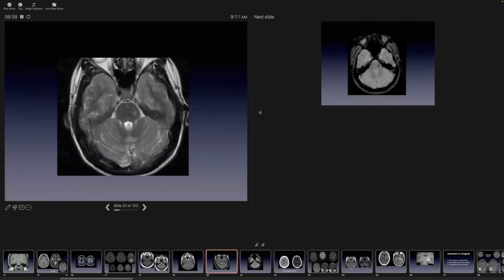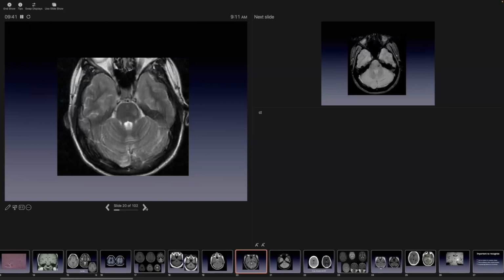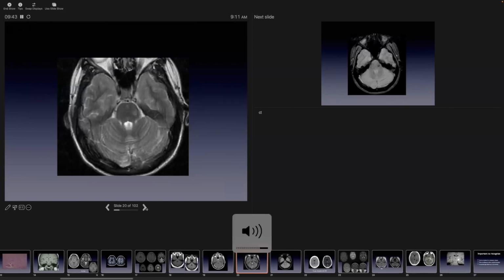Sorry, Alex, have you seen any cases when you don't have signal drop off on SWI?